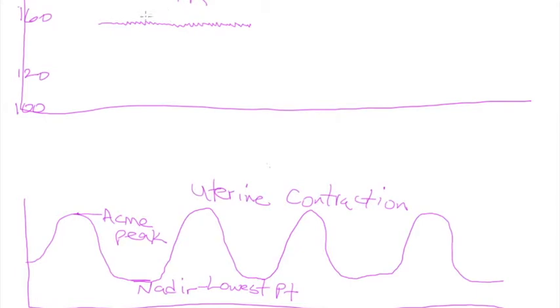This is minimal. If you get to the point where it's absent, remember, absent's bad. We like fluctuations.